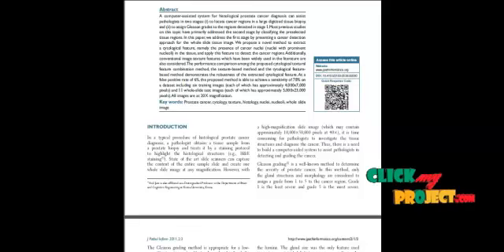Here we are using a median filter. The median filter removes the noise in the tissue images. Then the images are segmented using object likelihood generalization. The segmentation refers to choosing the required region of interest.